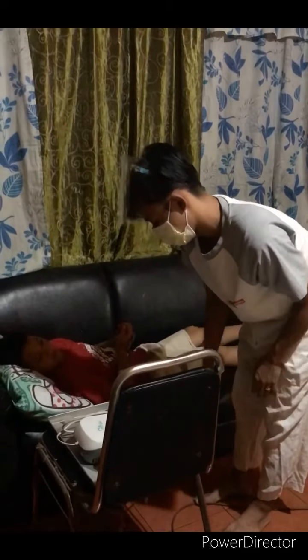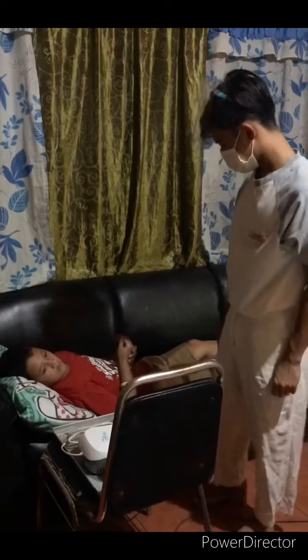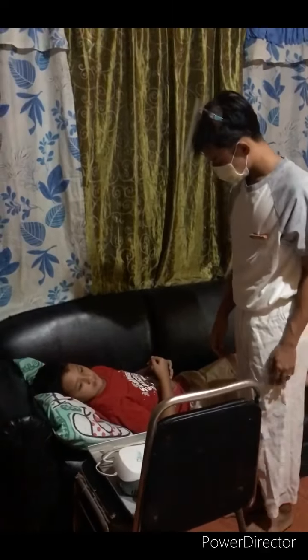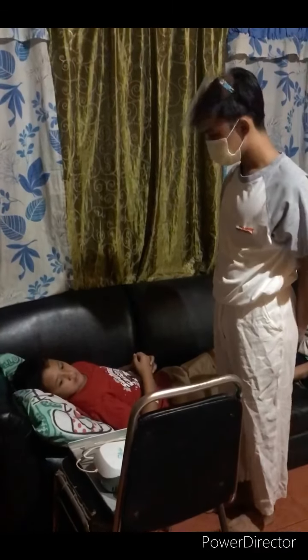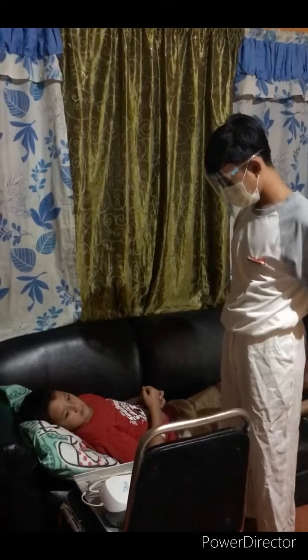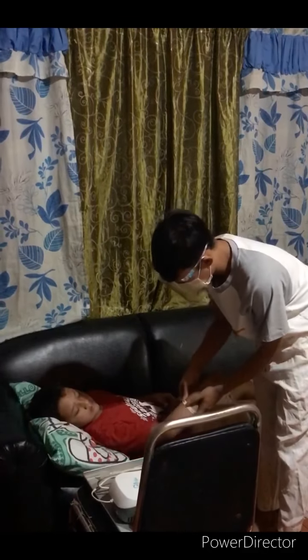Transport medications to the patient's bedside carefully and keep the medications in sight at all times. Careful handling and close observation prevent accidental or deliberate disarrangement of medications.